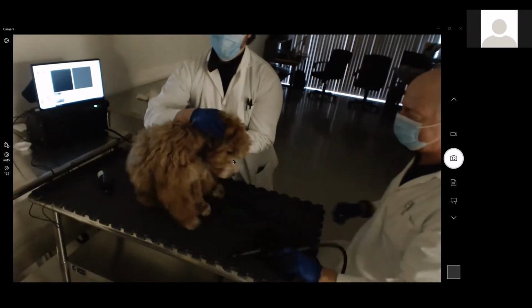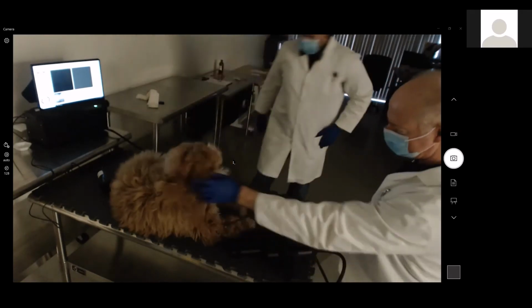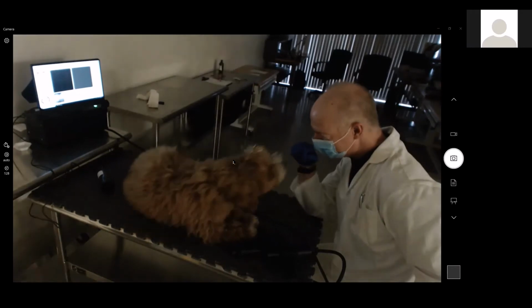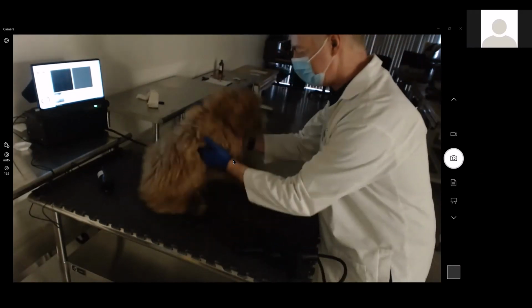I need you to bring it back here. Okay, let's let him go for a second. All right, good boy. De-stress. Hey, I've got something for you. Come up. Sit. Sit up.